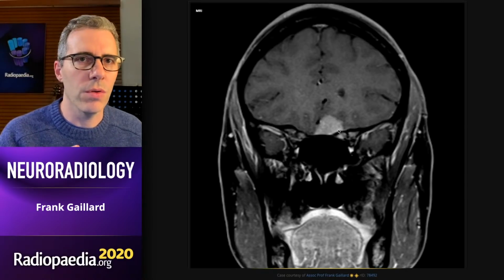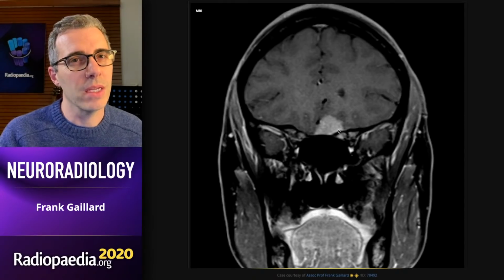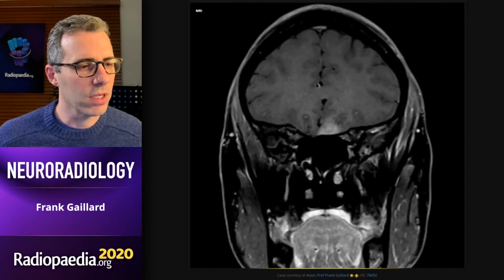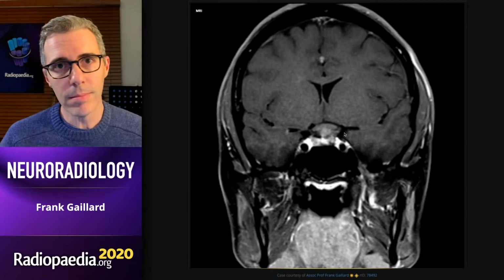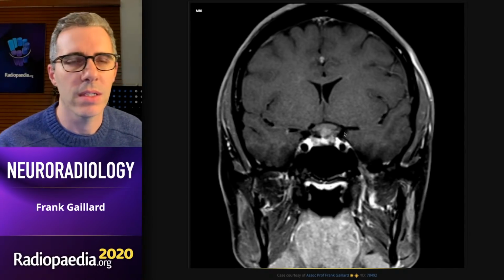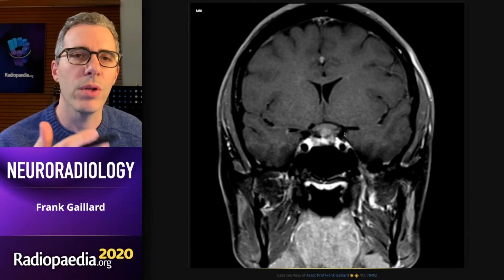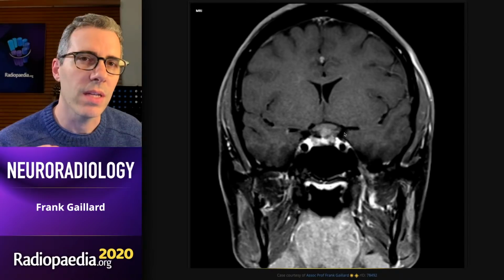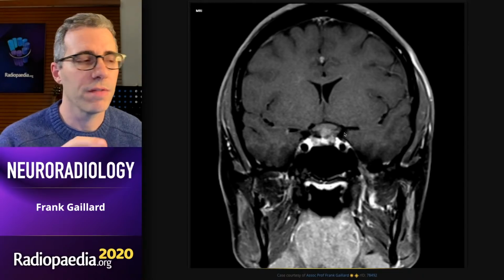And to do this well, you need fat-saturated sequences, but you need more than just fat-saturated. You really should be getting spin echo or black blood sequences. And by black blood, try saying that after a glass of whiskey. By black blood, I mean sequences where flowing blood appears black. Increasingly, we're doing 3D volumetric scanning for post-contrast T1s, such as an MP RAGE, pre and post-contrast. And that's great because you get all three planes in one go and you can reconstruct it and there's no skips between adjacent slices. The problem is venous blood as well as arterial blood will all be bright white, and it can make small amounts of tumor much harder to identify.